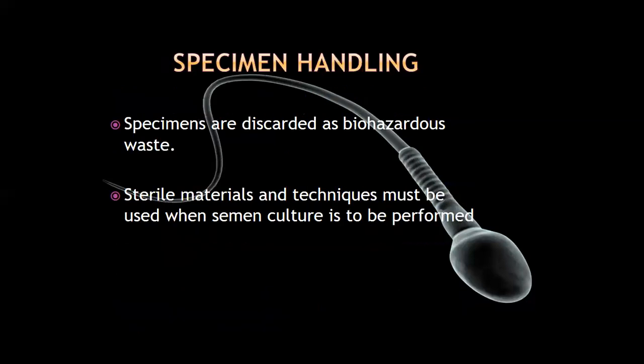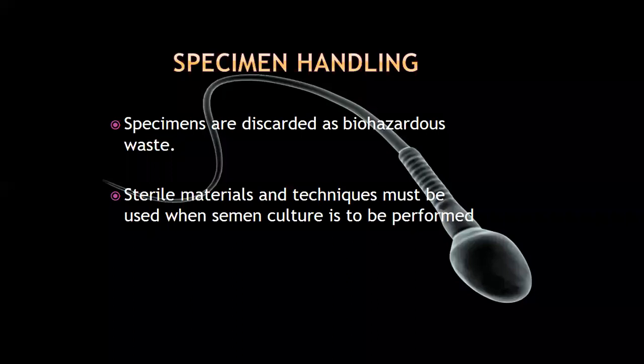After you have performed the entire analysis, you have to discard this in the biohazardous waste bag. It's because remember, this might be a reservoir or source of HIV infection, hepatitis infection, or any other sexually transmitted diseases. And sterile materials must be used, especially if culture should be performed.